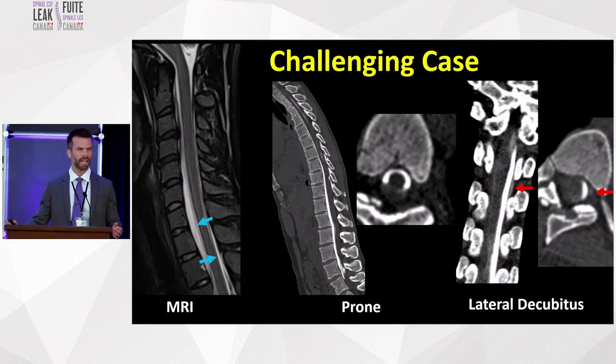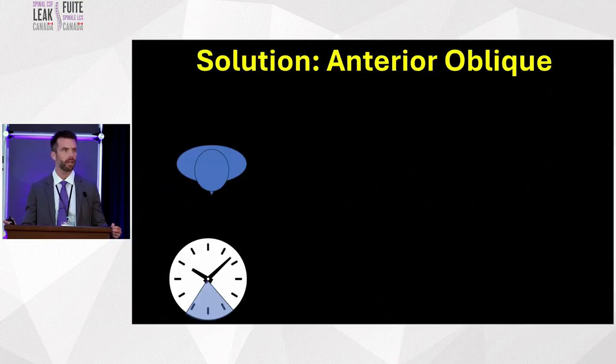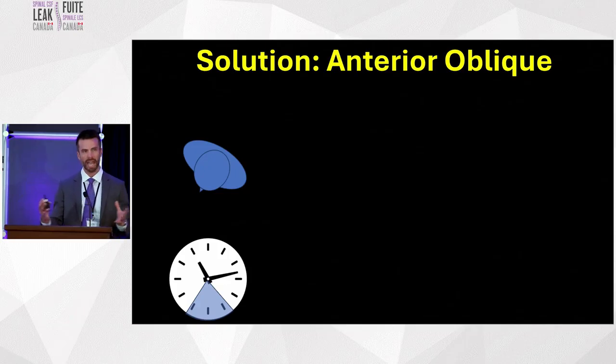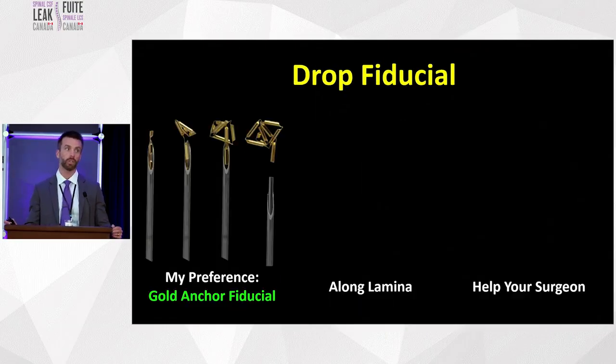We turned them on their side and saw this hazy sort of extravasation of contrast out there on the left, but it wasn't this classic lateral dural tear appearance either. And so what we did instead is just had the patient a little bit anterior oblique, just turn them a little bit with that clock face analogy, getting the dependent contrast bolus, again, in that sort of more axilla region or ventral lateral region, and redid our exam and very much more clearly here see that extravasation of contrast there too. So it's not always just perfectly midline or perfectly lateral. Sometimes you're gonna have to troubleshoot by turning your patient a little bit.